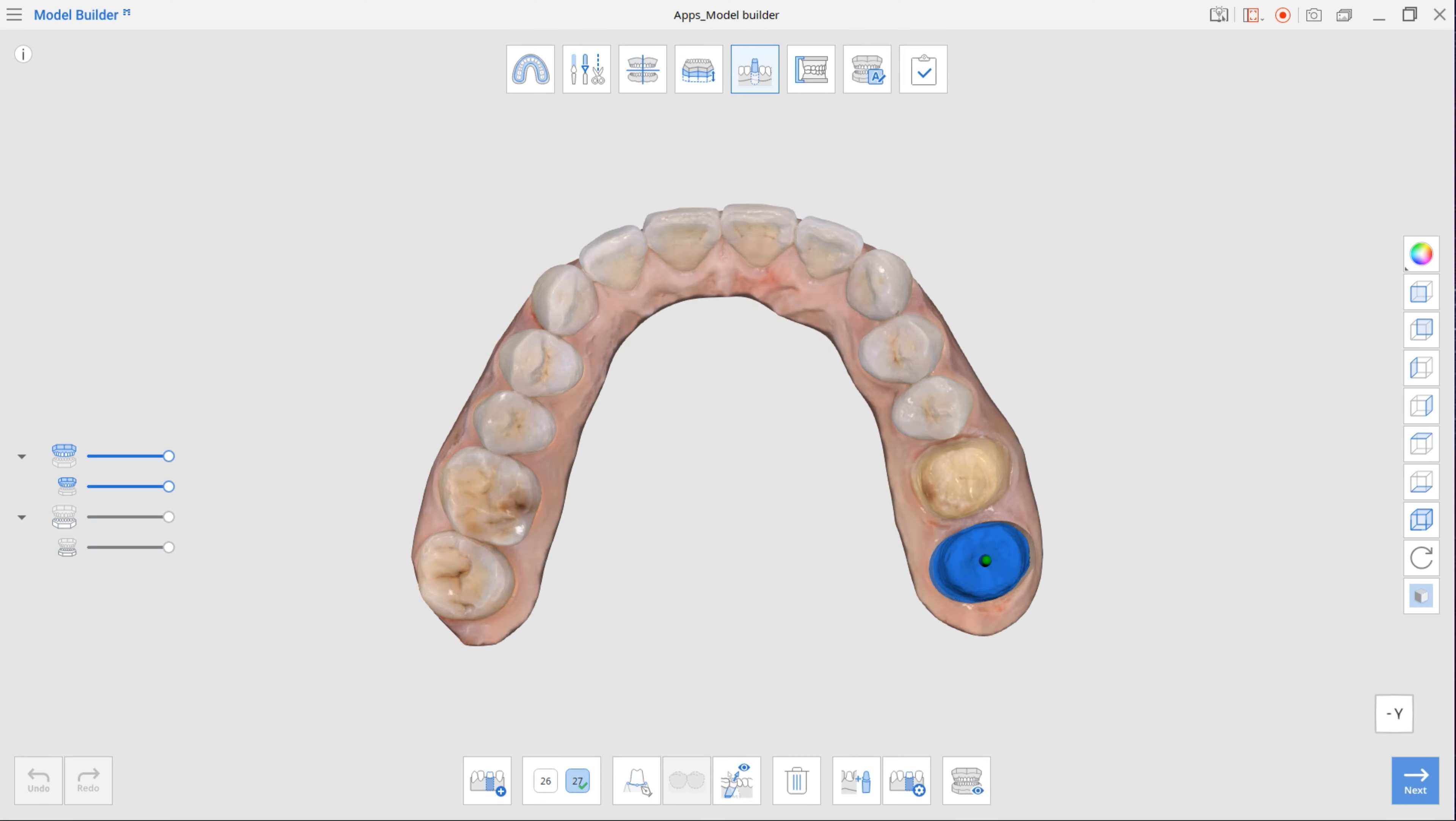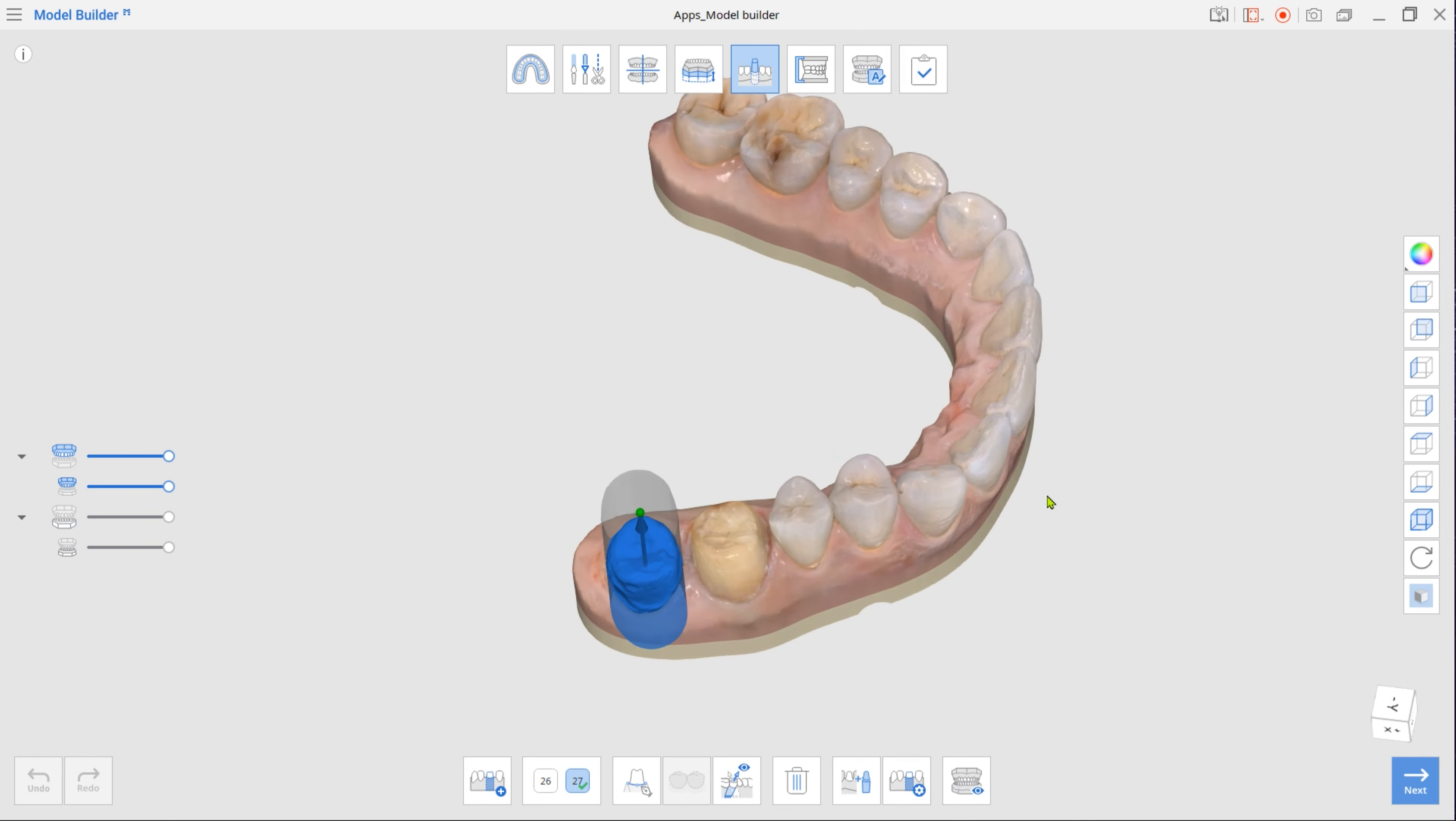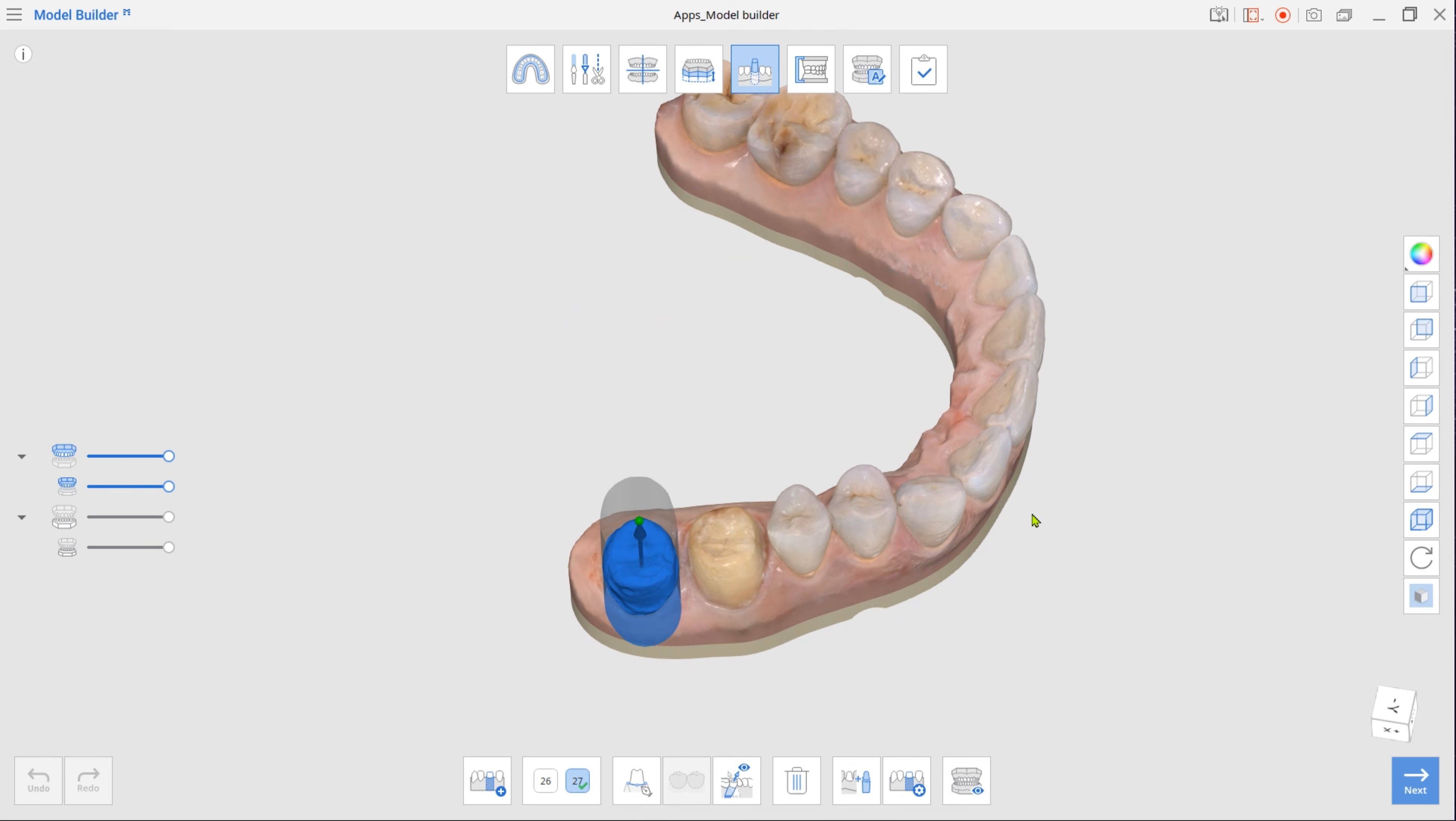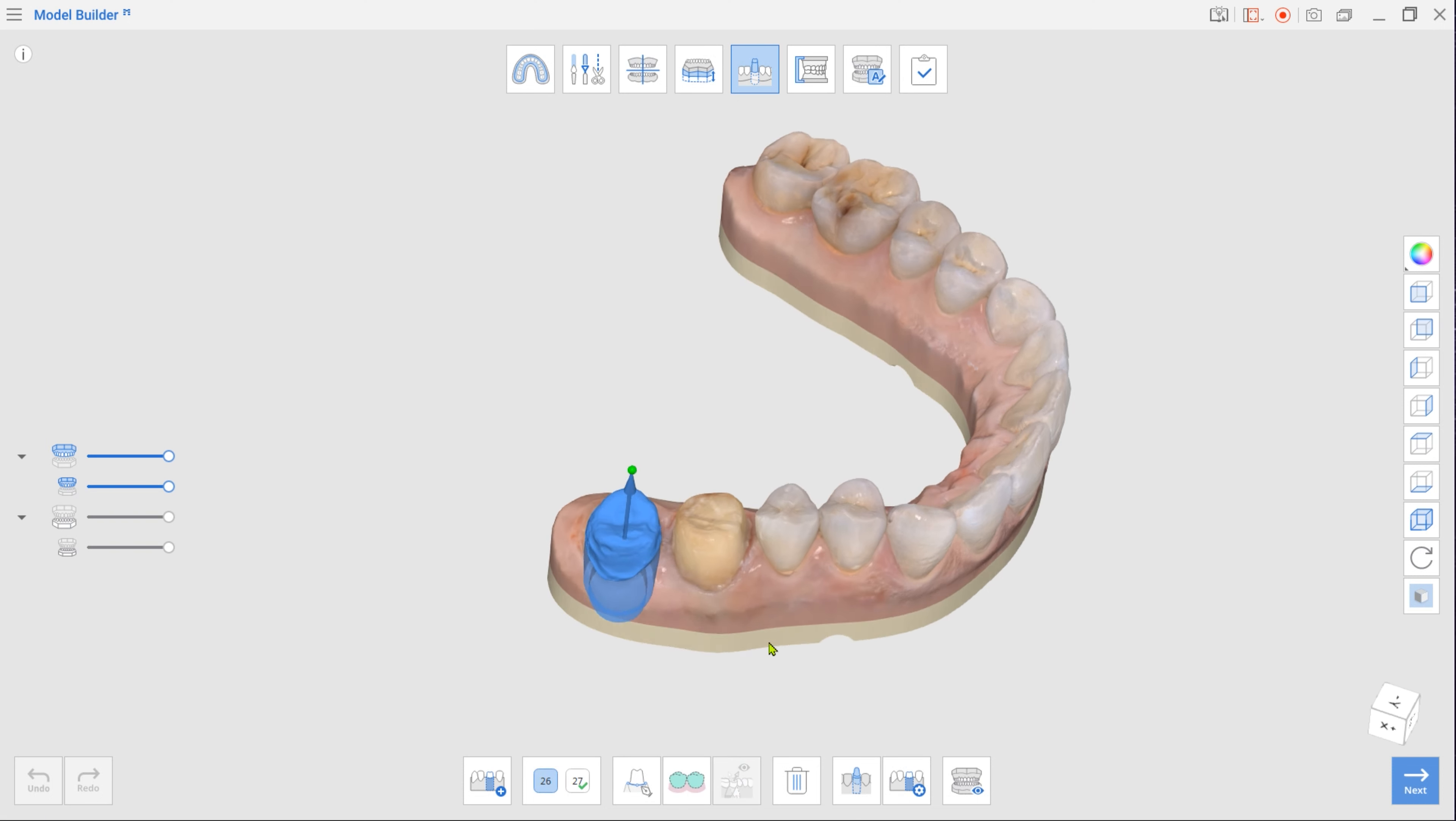If you drew margins for the prepped teeth in MeditScan for clinics, your dies would be created automatically. If there are no imported margins, first select a tooth number in the toolbox and click Margin Line.